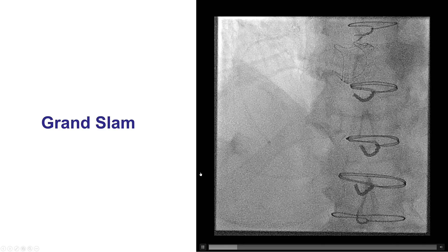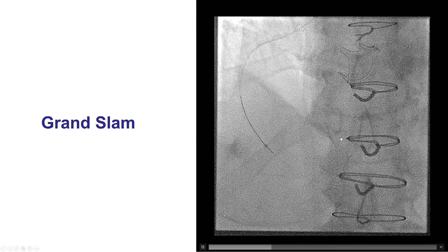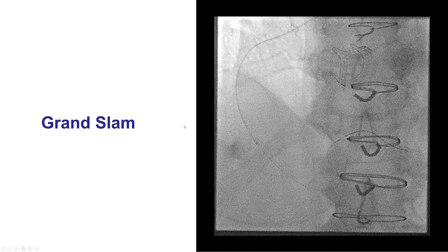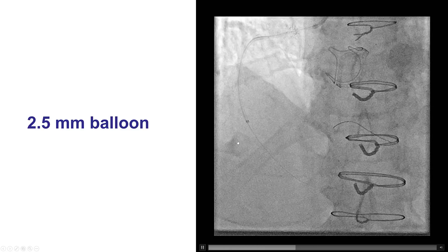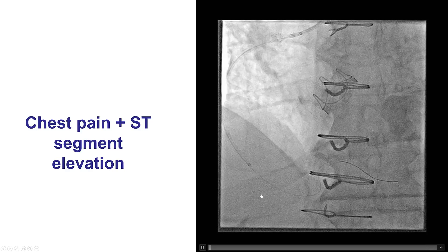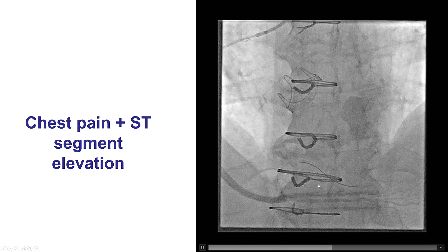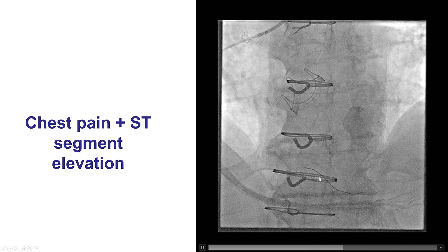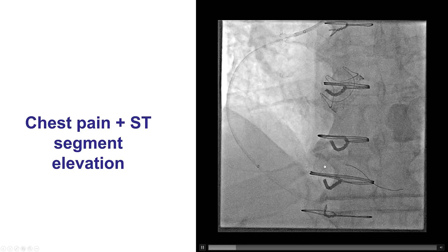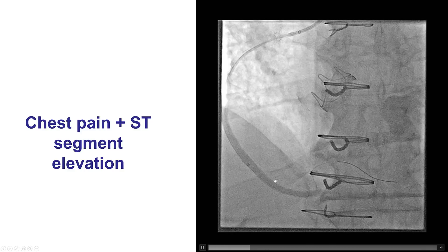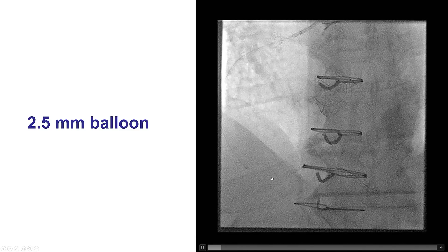We finally decided to change to a more supportive guidewire. Using a Caravel micro catheter, we advanced a Grand Slam — a very stiff body wire — to provide more support for delivery. After doing that, we predilated a little more, at which point the patient developed chest pain and ST segment elevation, indicating acute vessel closure likely due to dissection in that area. The critical first step when that happens is to be extremely careful not to lose wire position, because the treatment is stenting, and if you lose wire position it can be very hard to regain position in the distal true lumen.